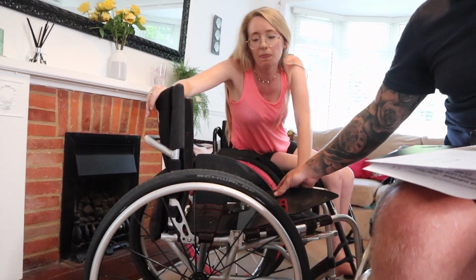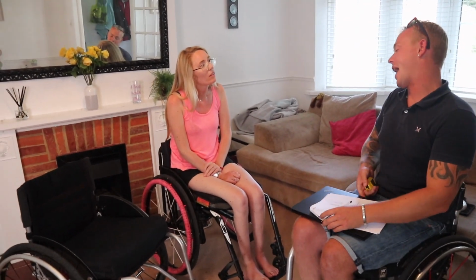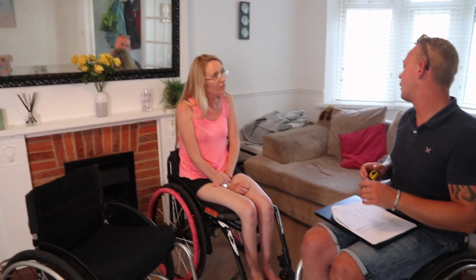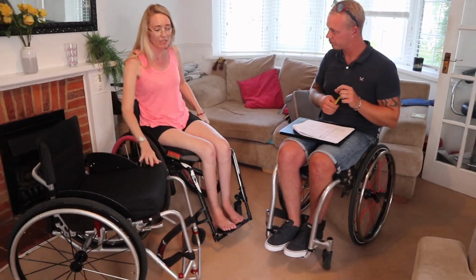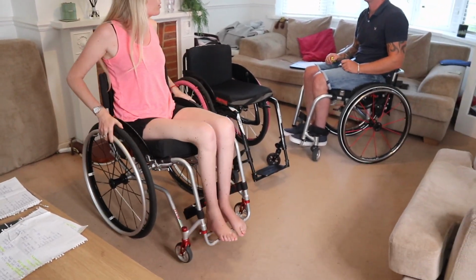And again, I can measure what's on here, and because of the length of your legs, I'm going to go a little bit extra to what's on here. Your balance of your axle. How tippy do you like a chair? Do you like it quite tippy, not tippy? I'm really happy with this one, to be honest. Okay. And that one too tippy? I think it was fine. Yeah. So this one, I think I could cope with this.